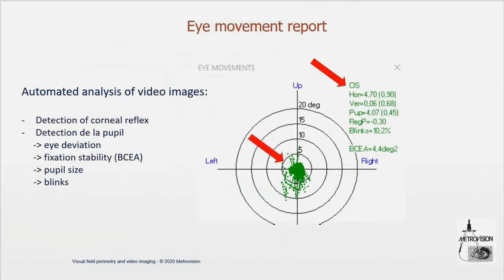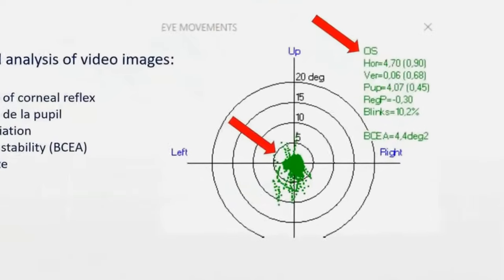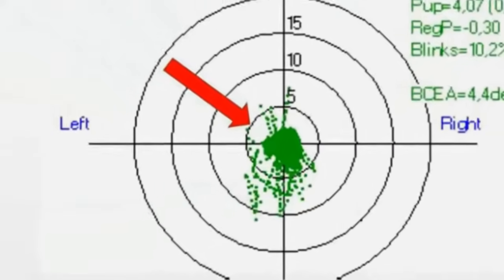You can display the eye movement versus time. But what is most useful for people who want to analyze the result is to use this graph. This is showing the cloud of fixations during the entire exam. So that could be five minutes, two minutes, one minute, whatever.